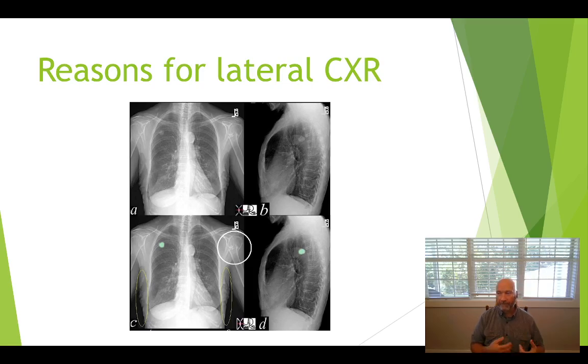and we carry that through into things like upper extremity, lower extremity. So in your camera, you're only seeing two dimensions. So if I were to put my fingers kind of close together like this, according to the camera, it probably looks like they're pretty close to touching. And they are, but it probably also looks like they are pretty much right on top of each other, as opposed to if I turn them just a little bit, you can see that there's a little bit of separation front to back as well.